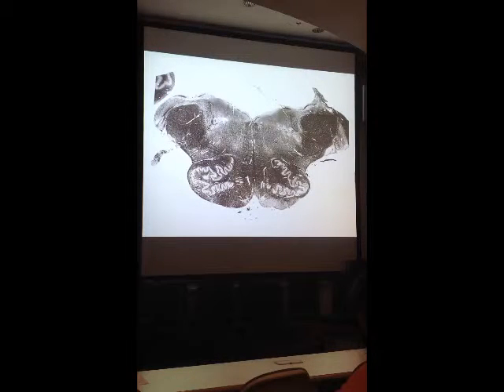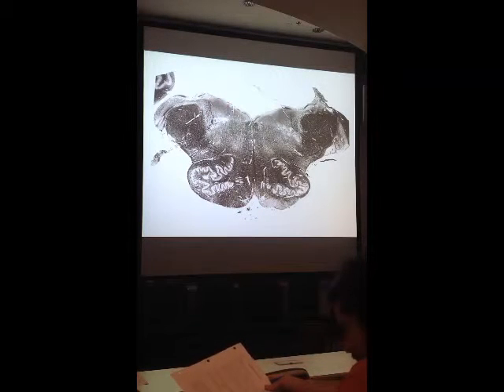So this represents the cochlear nuclear bundle. Cochlear nuclei is good enough. These are secondary neurons of the auditory pathway. And if these are cochlear nuclei, which receive input from the nerve, you might well guess that most of this nuclear area also receives fibers from a different division of the nerve. This is part of the vestibular nuclear complex, and it's huge in the floor of the fourth ventricle, in this case in the upper medulla. So again, vestibular nuclear complex, cochlear nuclei.